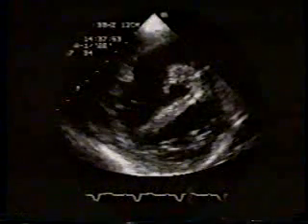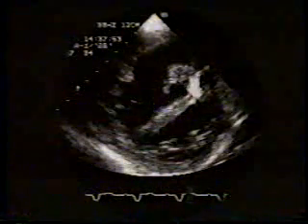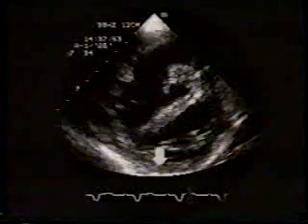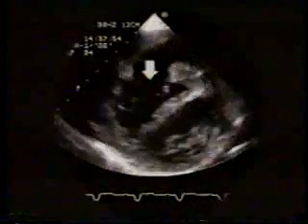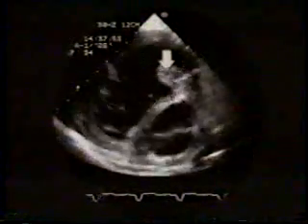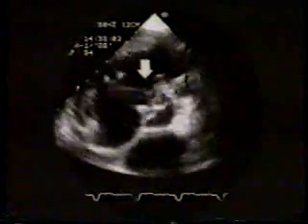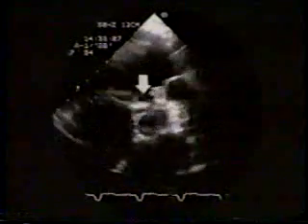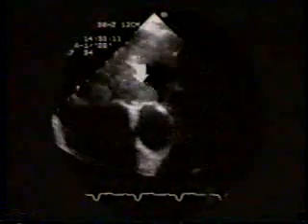This is the parasternal short axis view. Note that the ventricular septum is flattened and the left ventricular cavity has a D-shaped appearance. In real time, note again marked right ventricular free wall hypertrophy, hypertrophy of the trabeculum septomarginalis, and as the scan is taken to the base of the heart, a large perimembranous ventricular septal defect with prolapsing of the tricuspid apparatus is seen.